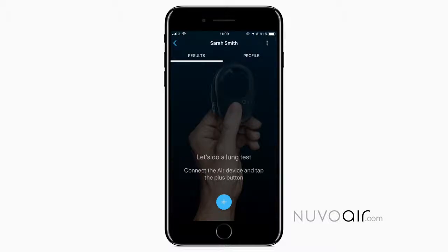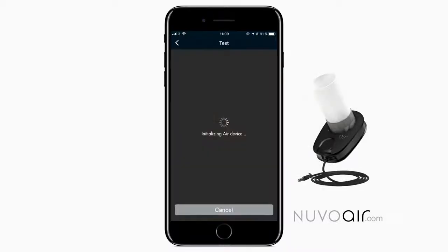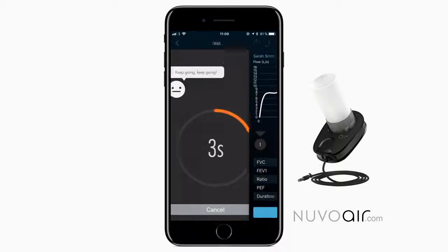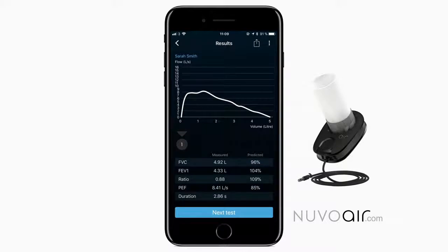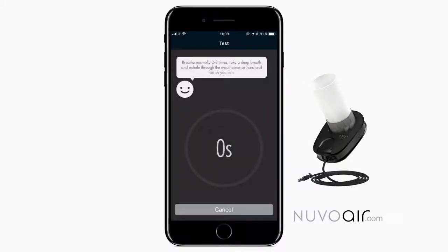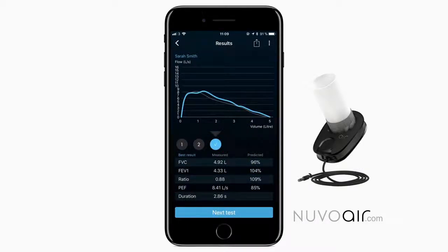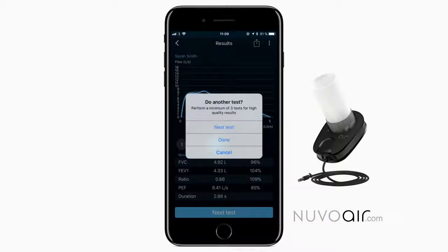Start a spirometry test by tapping the plus button. The app will guide you to do at least three tests. You can easily see which test is the best. For this demo, I'll only do two tests.